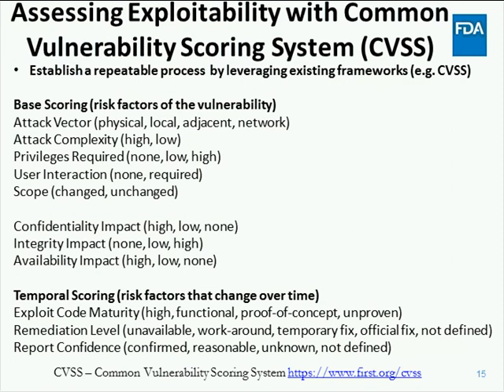When monitoring resources such as the National Vulnerability Database maintained by NIST, please note that the CVSS base score may be the only information provided, which necessitates the medical device manufacturer conduct further analysis, including filling in the temporal score. The temporal score are risk factors that change over time, such as the availability of exploit code. We recommend going to CVSS 3.0 to explore that topic further.